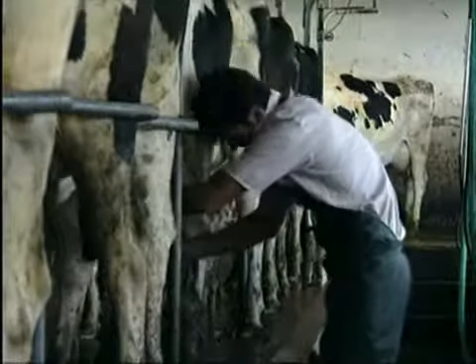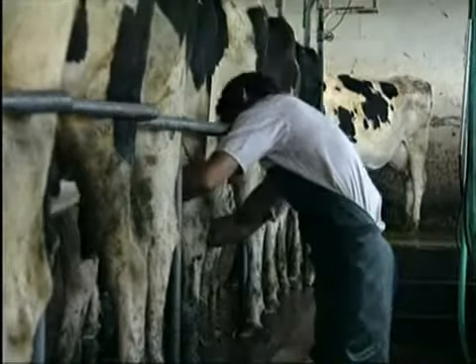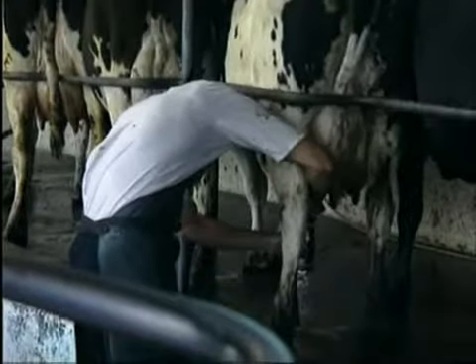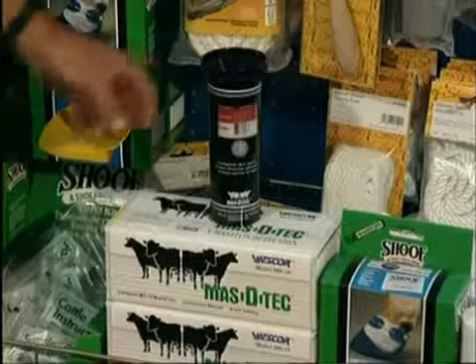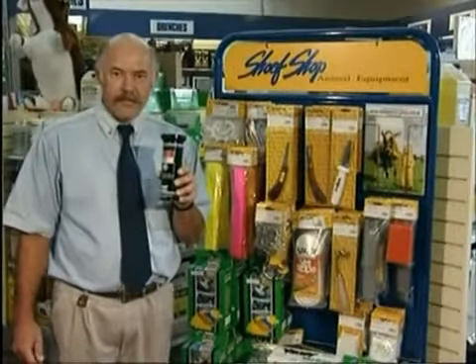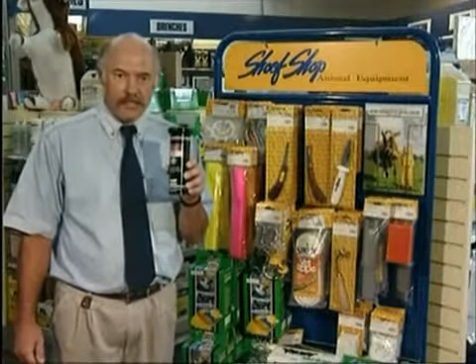You can use Mastitec to find infected quarters following herd test results, to check through the herd to find suspected infections, or to monitor antibiotic treatment results. Use it at the start of the season to check all new cows. This little device can save you thousands and help keep our milk products at the highest international quality standards.